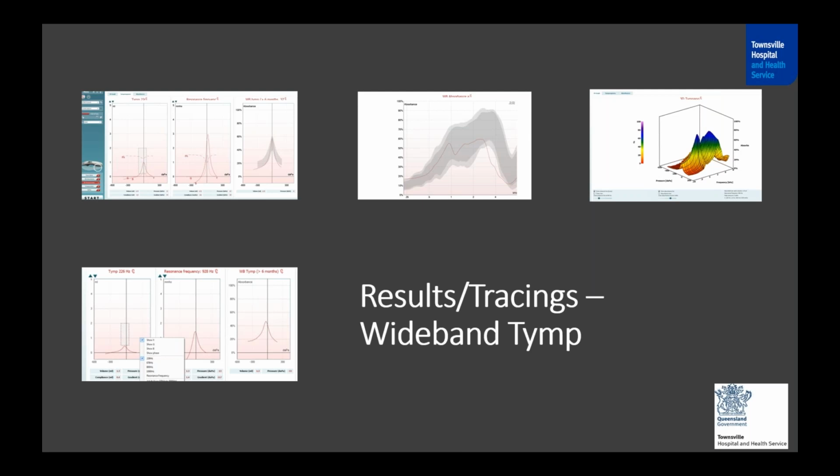If somebody is using a lot of multi-frequency tympanometry or multi-component tympanometry, then this test becomes very useful, because with one wideband tympanometry, we can extract 226, 660, 800 Hz, or a multi-frequency tympanogram with the different components B, G, and Y. So you don't have to repeat the test again and again, but these are derived from the click stimulus. They're not a direct measure as you would get in the other tympanometer. So in one go, in a shorter time, you can analyze separately with all these results. That is an advantage of having wideband tympanometry, but it's all derived from the wideband signal, not a direct measure.